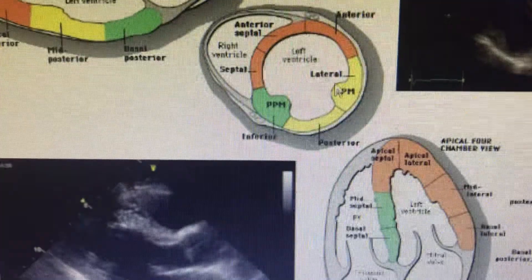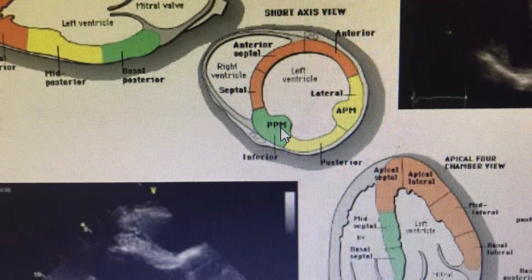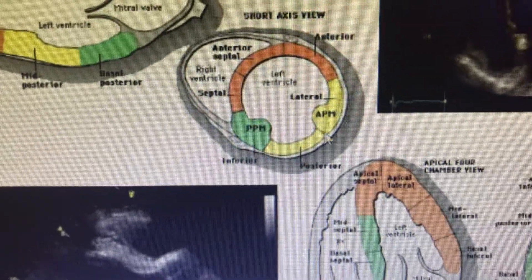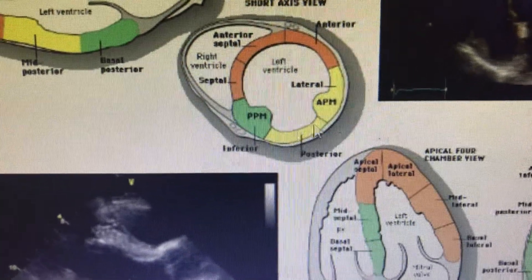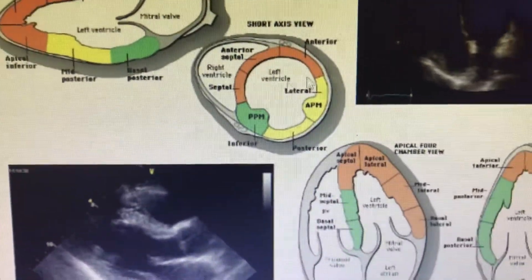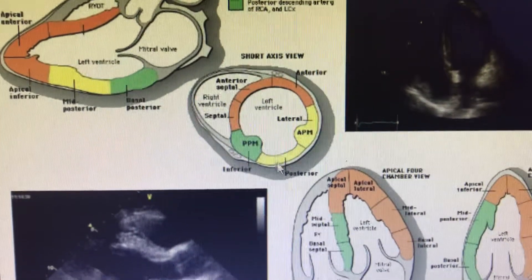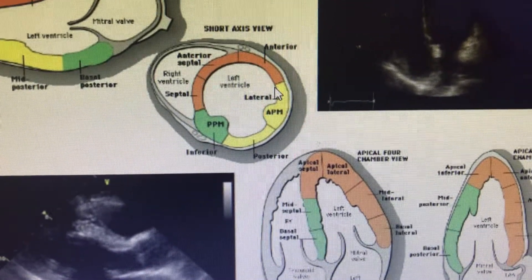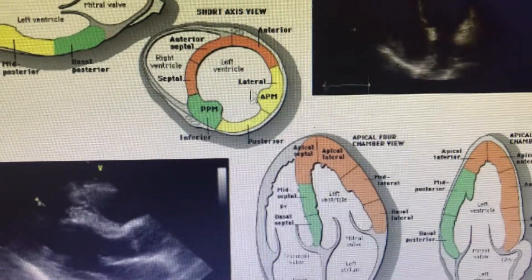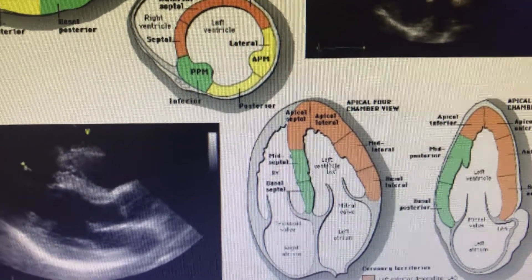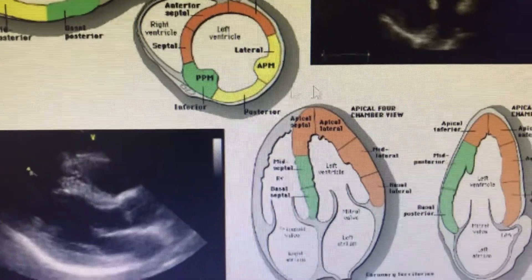For LAD territory, you would have to go to the parasternal view. The parasternal view — predominantly at the mid segment, mid level of the short axis view — at the papillary muscle level, you can see a large area supplied by the LAD territory. If you are seeing some regional wall motion abnormality in this area, then most probably you are dealing with the LCX/OM territory. You can count the number of segments having hypokinesia, akinesia, or dyskinesia. As the number of segments increases, the severity of the patient's regional wall motion abnormality and the patient's prognosis goes on worsening.